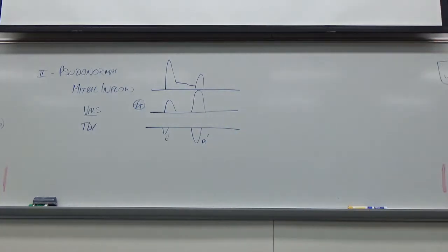Are all the scales the same as impaired, or are you gonna like shrink them just a little bit? The scales should be around the same. It's just where do I generally set this up when I go in to do my Doppler. You'll customize it depending on the patient, and it will vary some.